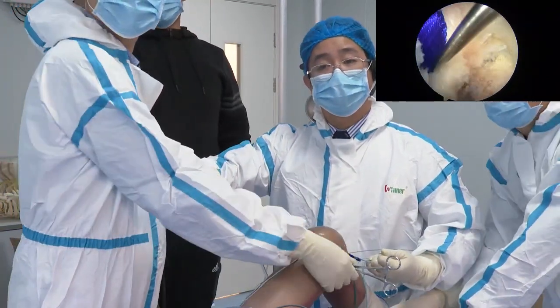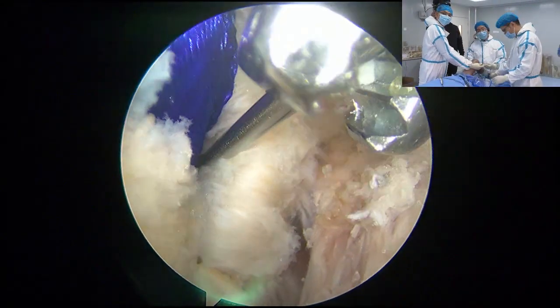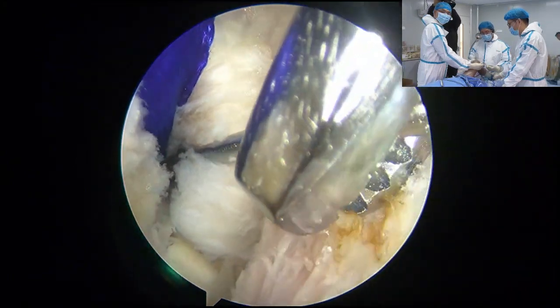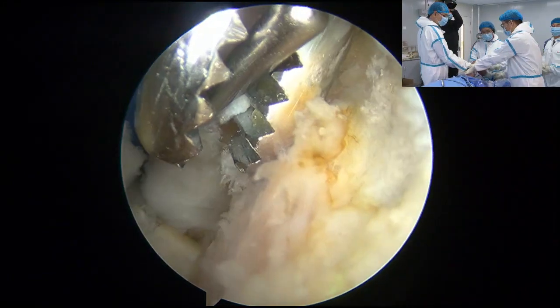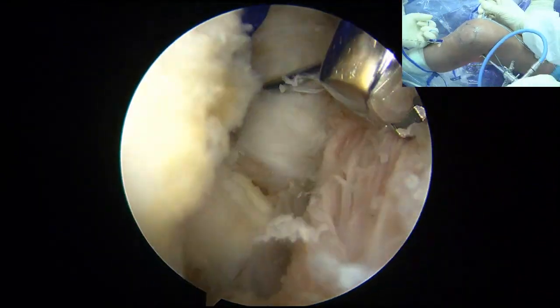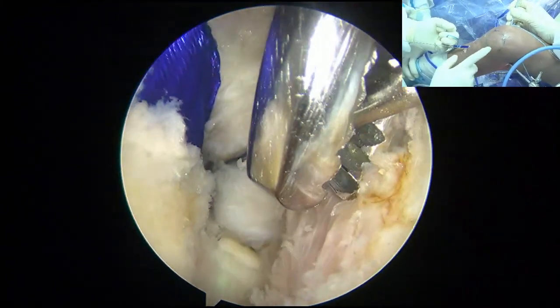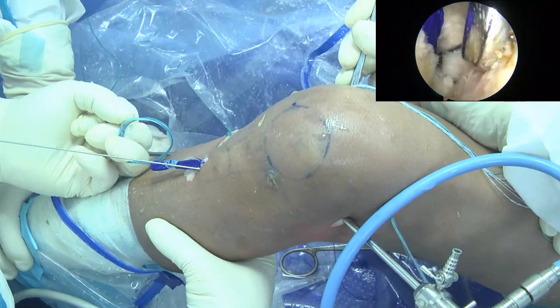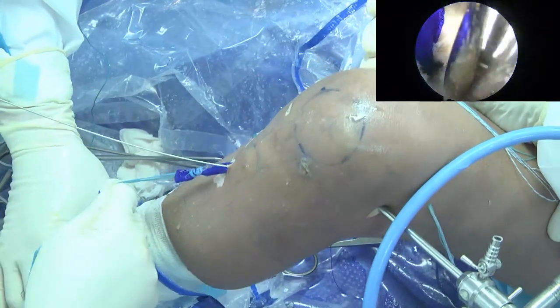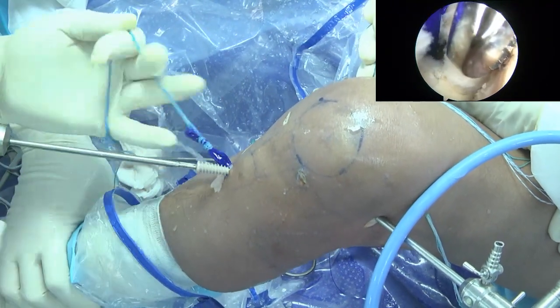So tension the graft. If you have an isolated PCL injury, I will do the anterior drawer. But if you have both ACL and PCL, we prefer to tension both at the same time, with the knee in 0 degrees of extension. But if you have an isolated PCL, I will do the anterior drawer because you have an intact ACL. Okay, good. What about the fixation angle for the PCL?